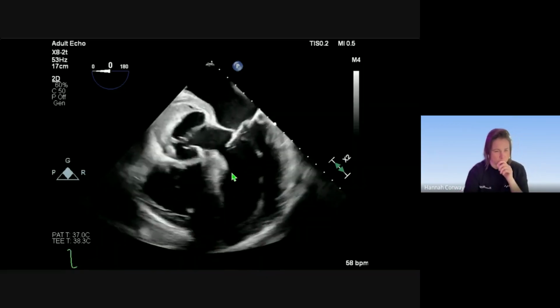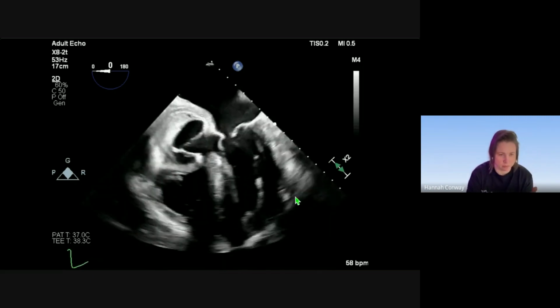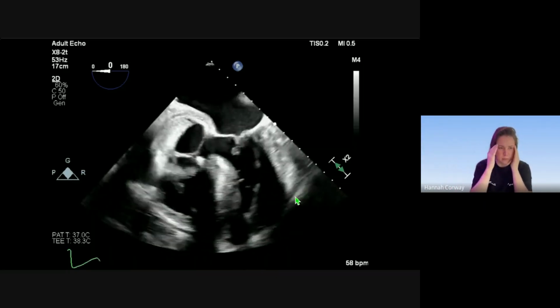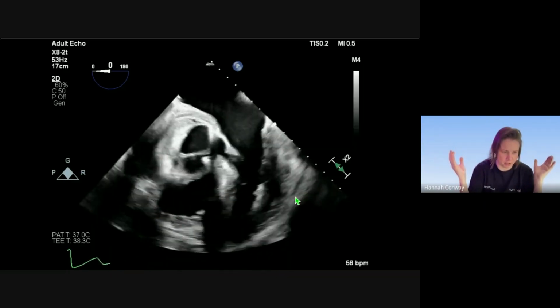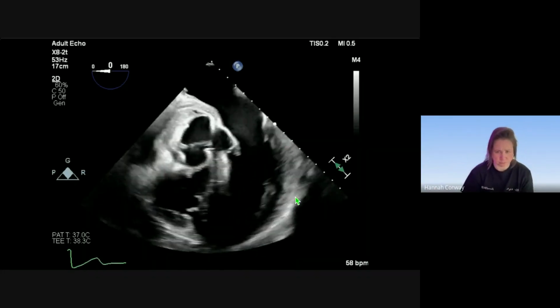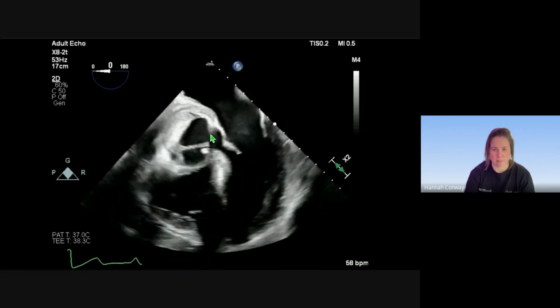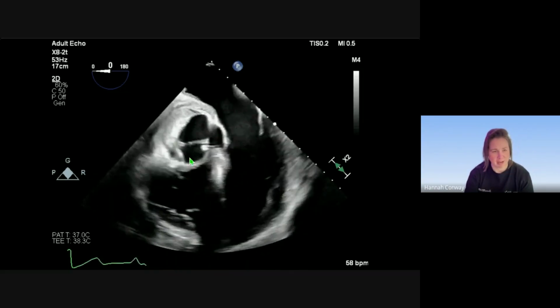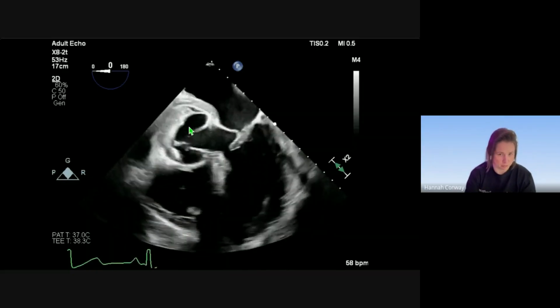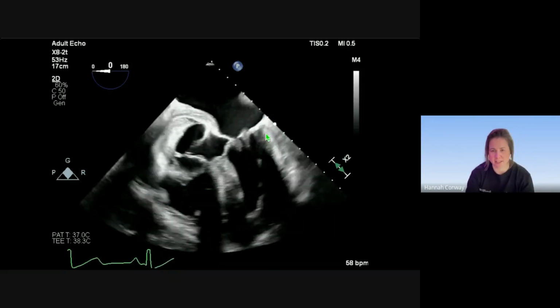So the first thing you said was that the LV looks like it's pumping pretty well, which is good, because even though we haven't looked at the full scan, we've alleviated one major concern, which was that we've completely knocked off our coronary supply. So that's one less thing to worry about. We've identified the flap. The fact that the aorta is right in the middle of the image is due to the fact that it's dilated and dissected.